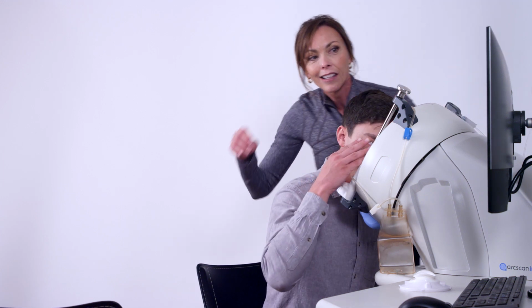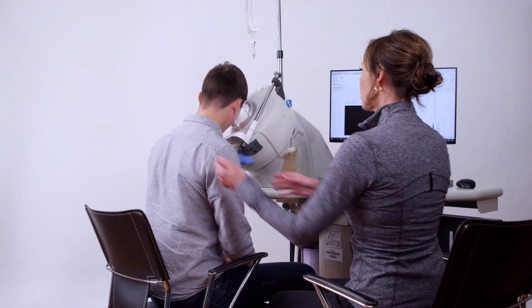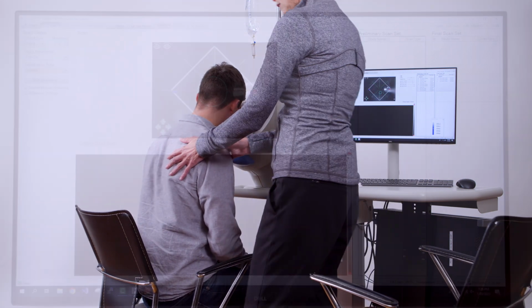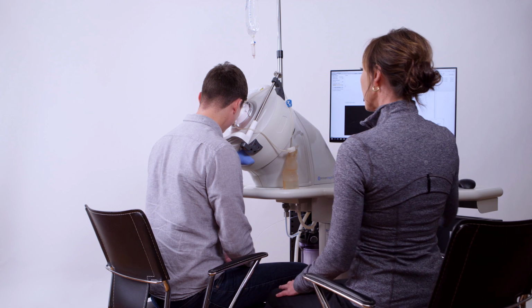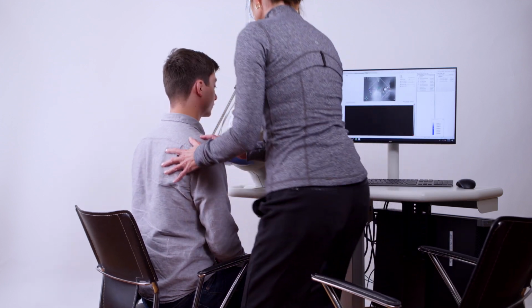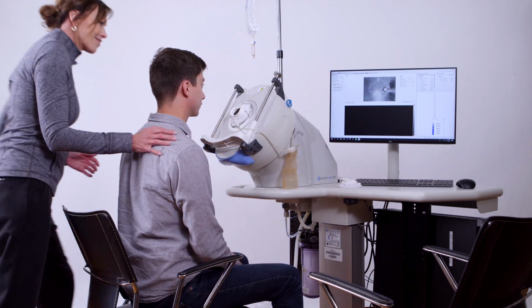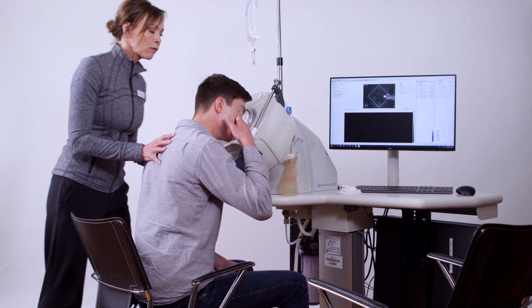I will help you get into position, and once you're in place, I'll release saline into this little cup. Your eye against the EyeSeal is what is containing that saline within the cup. Inside, you will see a fixation light, and your job is to keep looking at that light as best you can. You might see some motion inside, and it might appear as though that light is flickering, but remember, nothing comes into contact with your eye other than the saline water. The eye that is being imaged, it's quite comfortable, it's hydrated. As far as the fellow eye is concerned, you can reach up with your hand and gently close it.